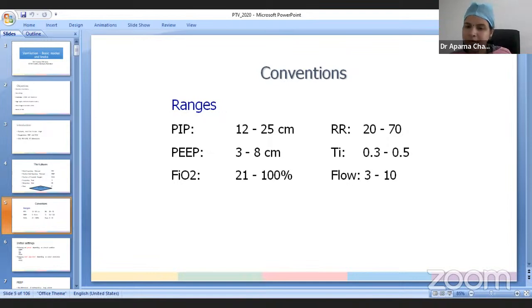If the FRC of the baby is moderately reduced, like mild to moderate HMD, 4 to 5, severe HMD and severely reduced FRC, then we begin with a higher PEEP, at least 5, maybe 6 or 7 in a ventilated baby.